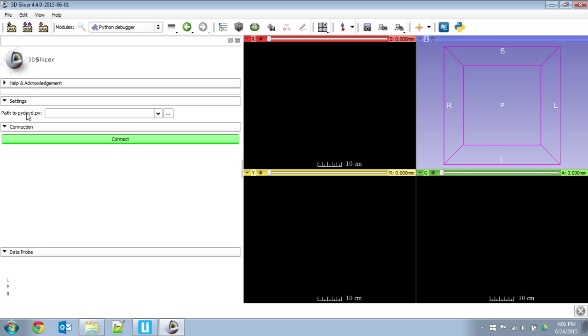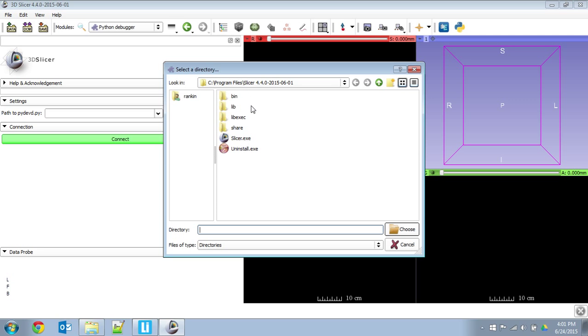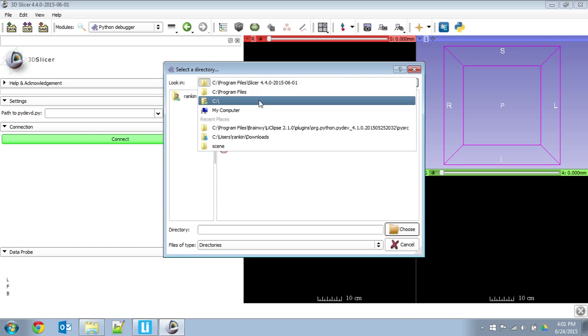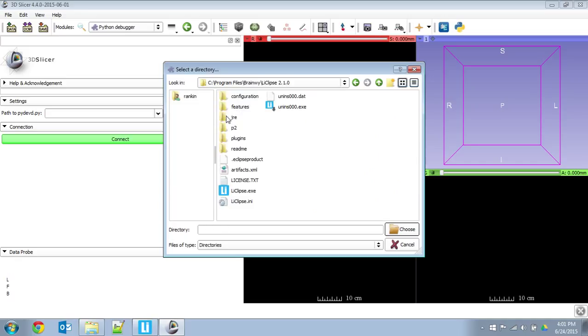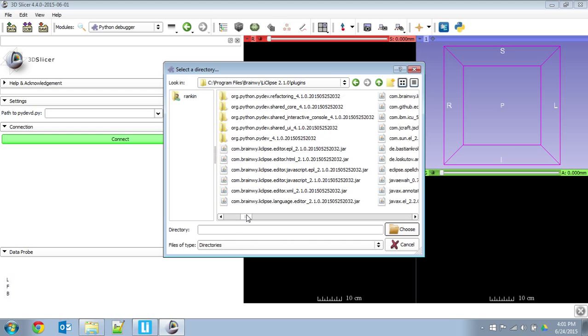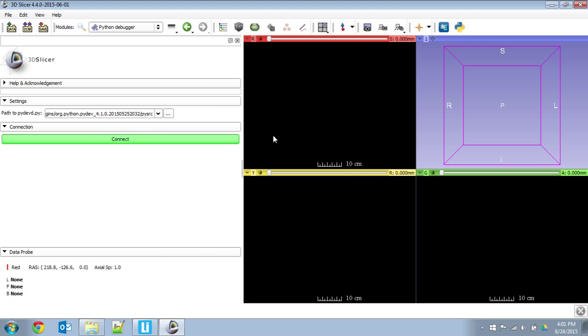So we need to locate this file, which came with your installation of LiClipse. So let's locate that now. 64-bit. Once you're in your install directory, it's under Plugins, org python pydev, then the version number. You choose the Py source folder, and hit choose, and that's it. You're done. So now we're going to connect it.